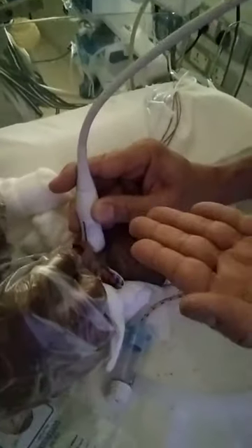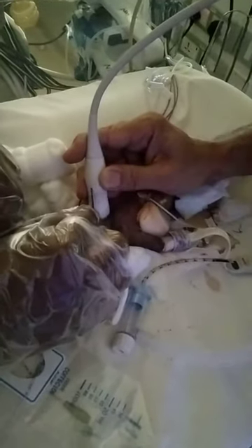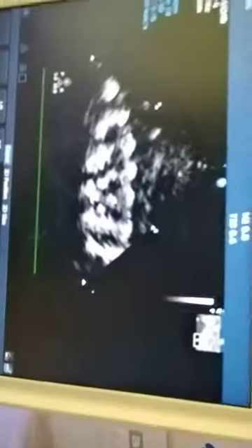You can see that the ultrasound is done with the probe placed in the suprasternal space and the marker facing up. It is a longitudinal view, and you can see on the ultrasound machine how I asked him to move the tube in and out.